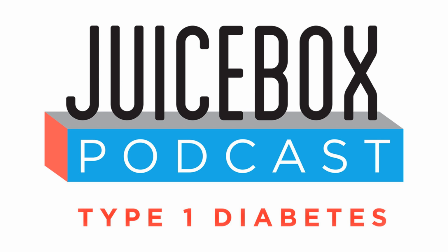Yeah. I'm going to have somebody, eventually I'll find somebody that's using the pump to be on the show, but it's pretty new still. I don't think I've bumped into five people who say they're using it. I also can't make a correction with it, right? Like I can't look at my blood sugar at 250 and go, I really wish I had more insulin. It's just doing what it's doing. Corrections, yep. No calculating boluses on the user's part. That's all the pump's driven, adjusting to the right doses, right?